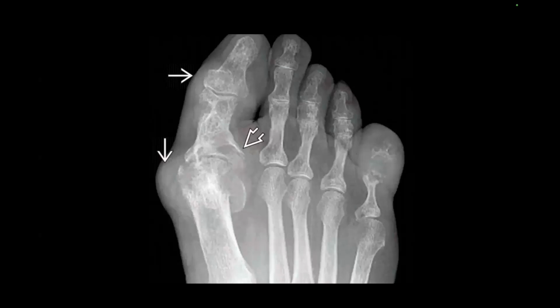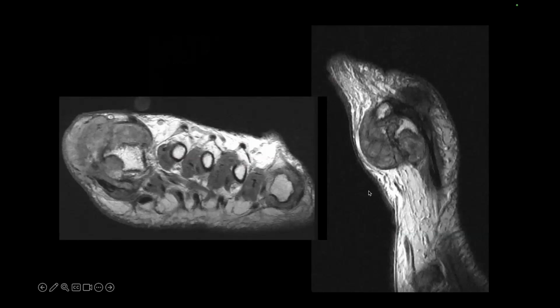And again, this is a more advanced case of soft tissue mineralization and density with these rat bite-like erosions with overhanging joint margins. There is complete destruction of these joints here, and this is presumably from gout as well.